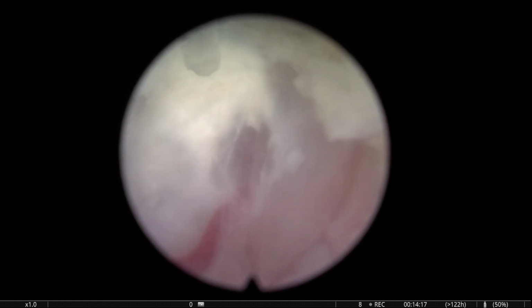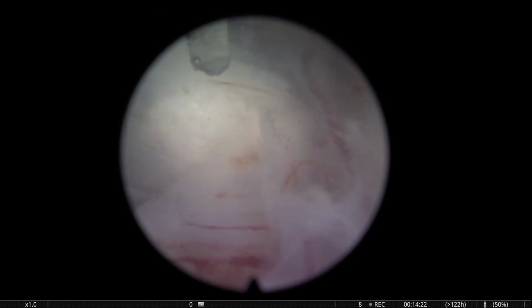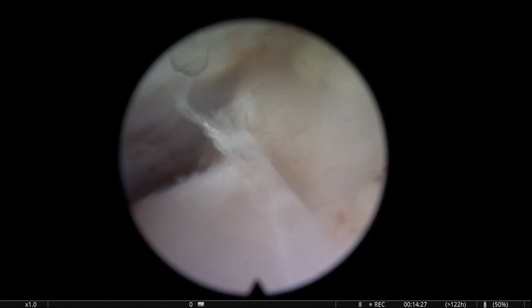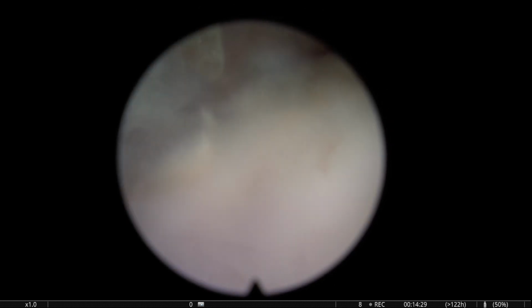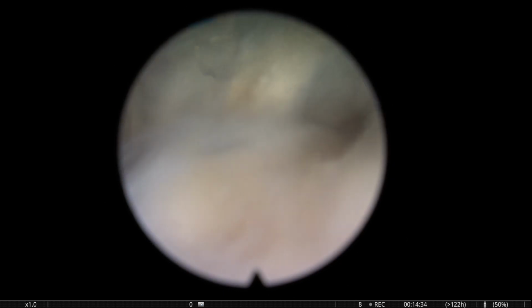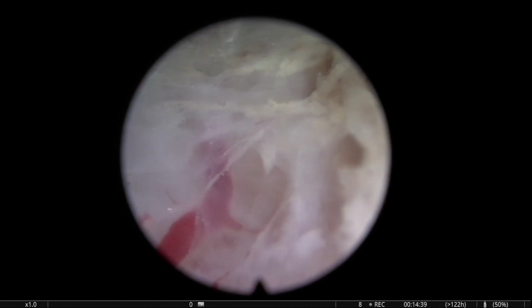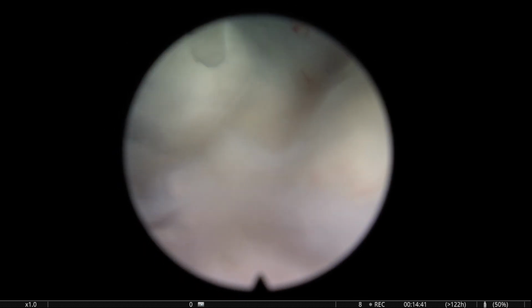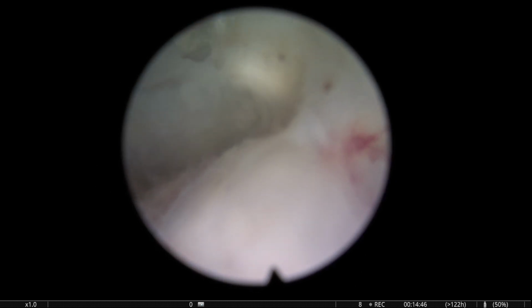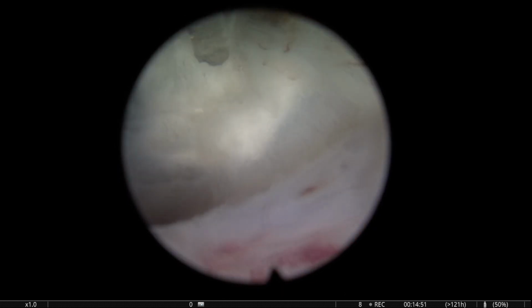So if you're going up in this direction on the right plane of the patient, of course you know that the line is going to start correcting itself as you get anterior, you know. So the recognition of the plane is not based only on what you see, it is based also on what you already know about the anatomy of the prostate. The lines have to be coherent, you know. If we have a nice depth in the posterior line and then we connect this line to the lateral line, you know, it has to make sense.